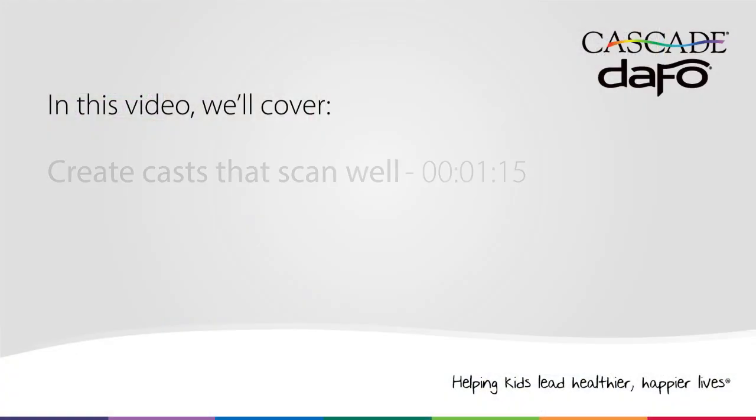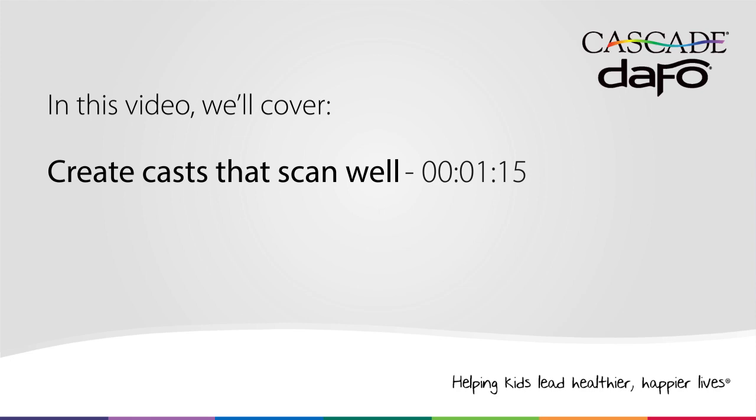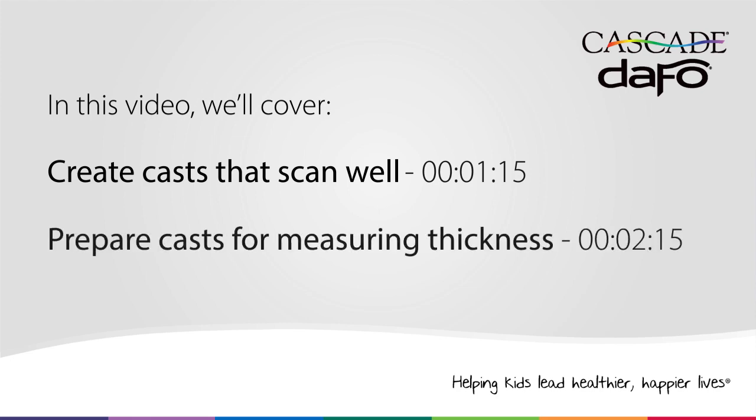Hi, I'm Micah. I'm the Digital Mold Application Supervisor here at Cascade DAFO. In this video, you'll learn what makes a cast suitable for scanning and how to prepare your casts for measuring thickness.